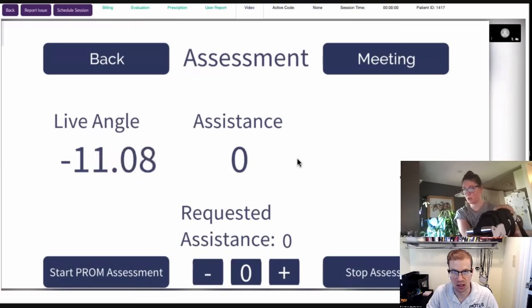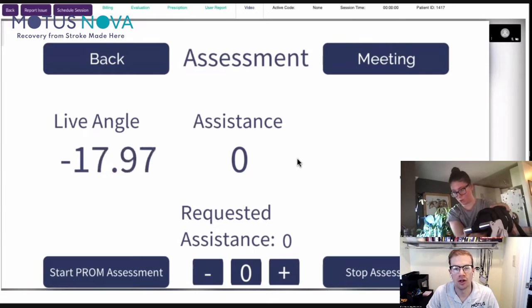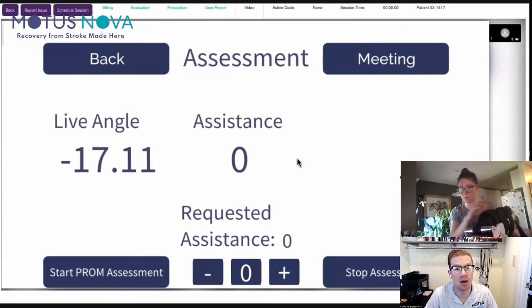Just relax for me, take a big breath in. Now, I'd like you to close your eyes really quickly, and try to move up as far as you can for me. Perfect. Now go ahead and open your eyes and look at where your numbers are, right? So that's very, very common where it went down.